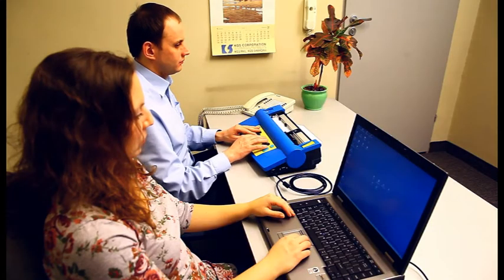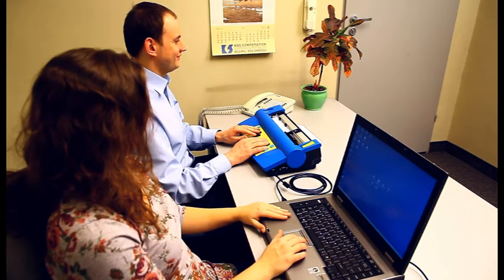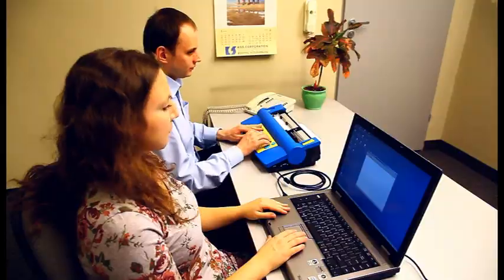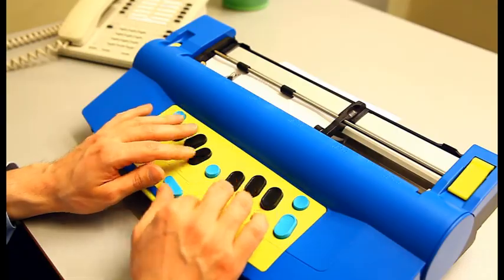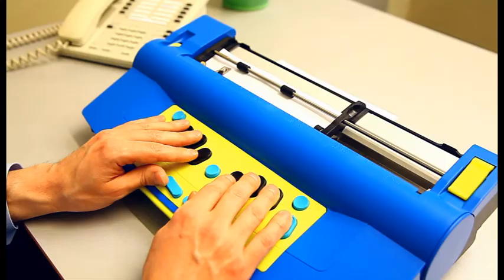MBCom is also a chat program. Before you begin, make sure the BUSB option is off — when you do the command BUSB on your Mountbatten, you need to hear 'off'. Chat is enabled by opening the File menu and selecting Chat. The Mountbatten says 'Back On', letting the Mountbatten user begin the chat. Forward and backward translations can be activated either from the Mountbatten with the Tab and Back Tab keys, or from the PC keyboard with the F1 and F2 keys respectively.